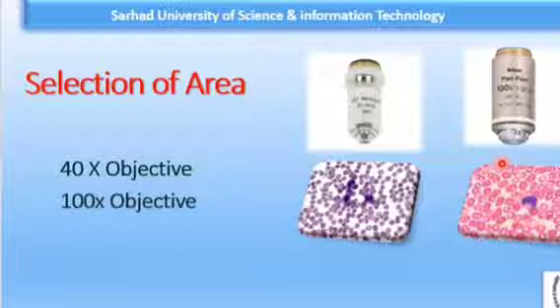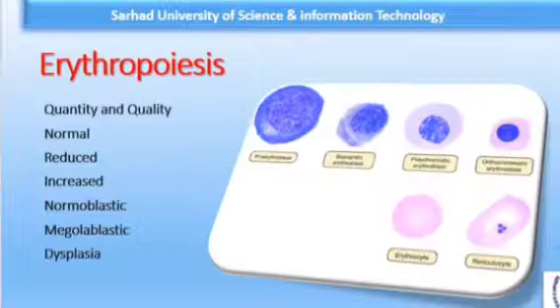Whenever you are looking at cellularity, then you are looking for megakaryocytes, then you look for osteoblasts, macrophages, mast cells, and endothelial cells. You look toward these cells, and then you find some abnormal cells. Now the exact hematopoietic cells you are looking for, like erythropoiesis, myelopoiesis, and some parasites. Now you are doing a myelogram. So let's start from here.